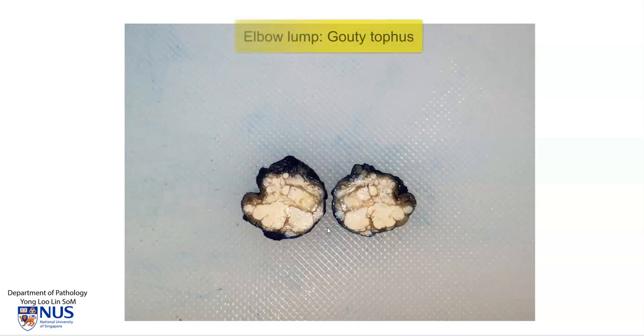This gross picture shows a bisected lump from the soft tissue of the elbow, with the external surface painted. Looking at the cut surface, we can see some very well-defined chalky deposits, which is consistent with the gross appearance of a gouty tophus.